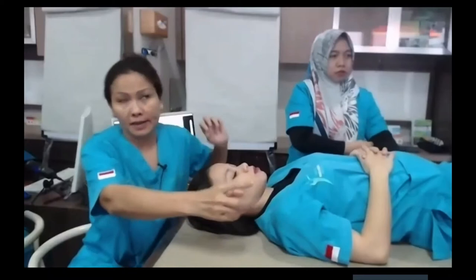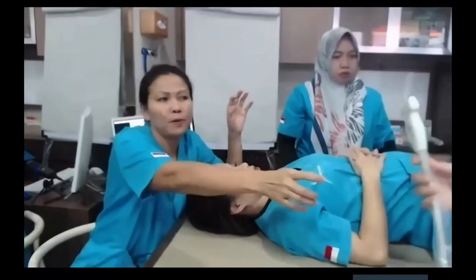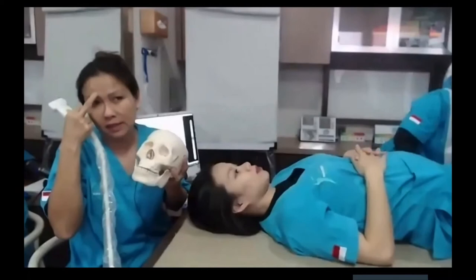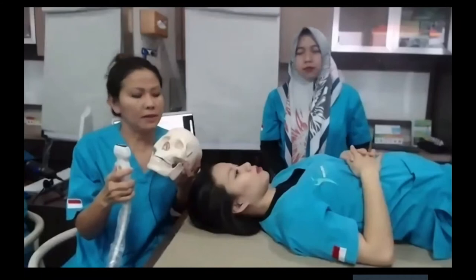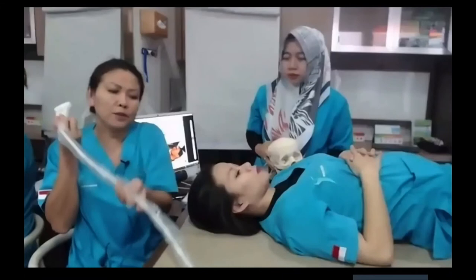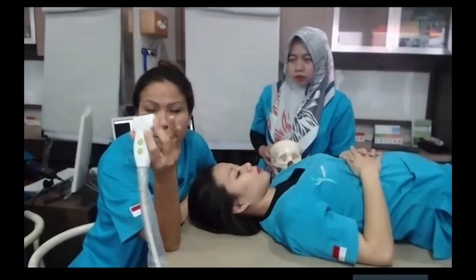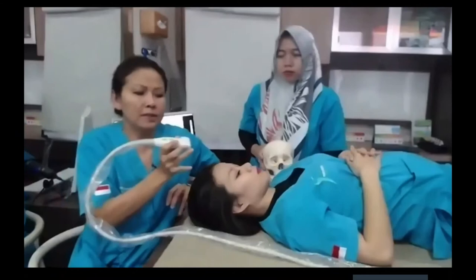I need a linear probe because the scalp here is very thin, right? Maybe it's less than a half centimeter, so the choice of the probe is the linear one. Okay, I always force myself to hold the probe like this. Which one you prefer is okay, but for me this one is nice. Three fingers to hold the probe and the other two fingers to anchor my hand onto the patient's body, so then the probe will not run here and there.